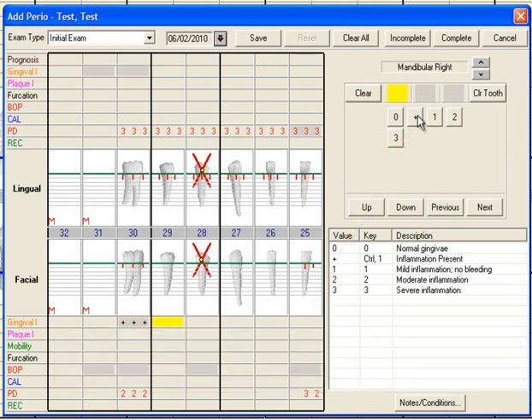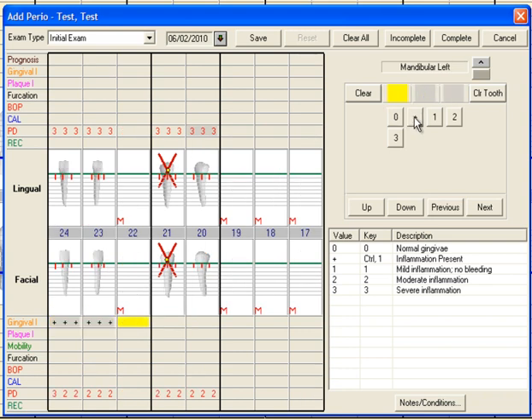Now, like pocket depth, this program will automatically advance itself for you. So you see it's defaulted up to the next sites for you to record. I'm looking here and I'm saying, yeah, interproximal, I do have inflammation, but you know what? Mid-facial, this patient is brushing very well, took care of it. I don't have anything going there, so I'm just going to go to the mesiofacial, and boy, we're inflamed there. So when I look at the chart, it tells me that I've got 1 site that showed no clinical inflammation. Again, we can record inflammation at all sites.